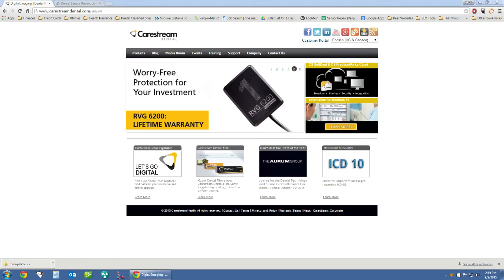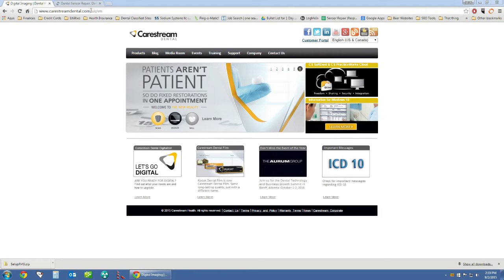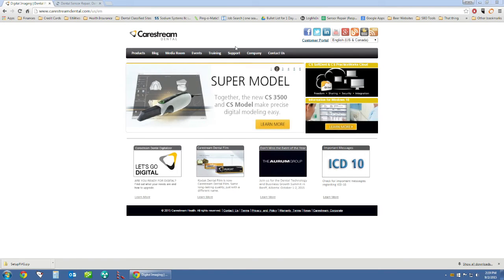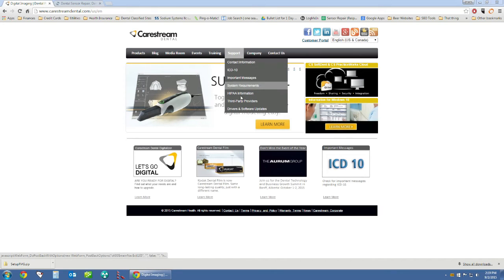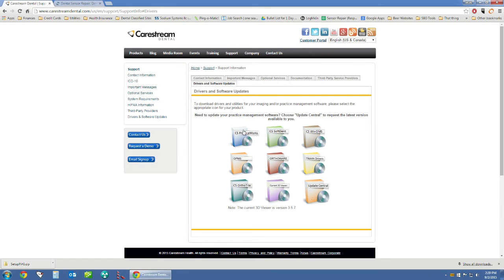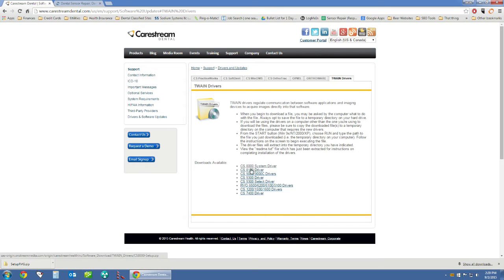The first step is to go to the carestreamdental.com website. On the main page, hover your mouse over the support button and go all the way down to drivers and software updates. Once on this page you will see a group of links. We want Twain drivers, so click on Twain drivers. On this page we see a list of drivers we can download. We want the RVG 6500/6200/6100/5100 drivers.